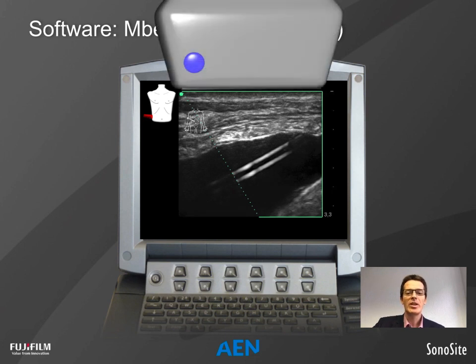So we have the probe sitting on top of the ultrasound image here, and now the sound travels onto this catheter and therefore creates excellent sound reflections back to the probe. And this is shown here in a pleural catheter. But there is one thing you have to keep in mind, because beyond this line with the little dots, the image isn't as good as inside this field.